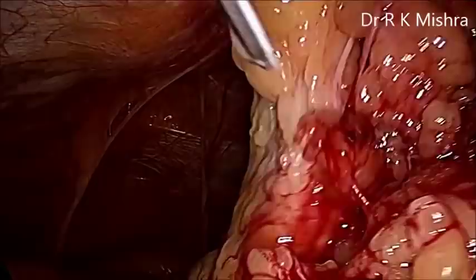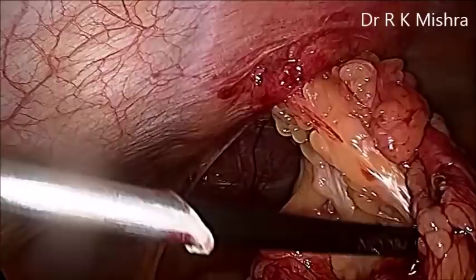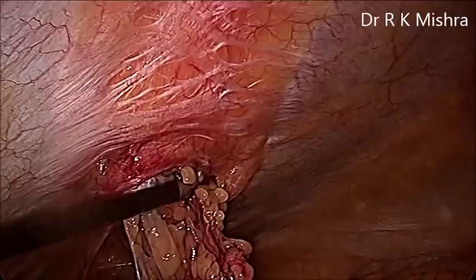Any component of the omentum should not be left inside during any ventral hernia repair. It is better to remove each and every component. Although the natural fat of the peritoneum can be left there, any external content should not remain inside the sac.